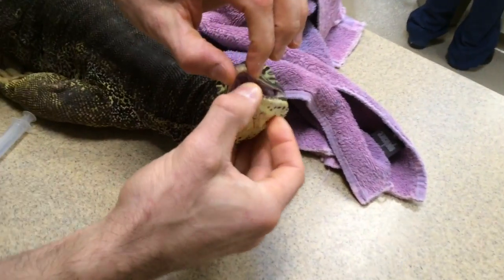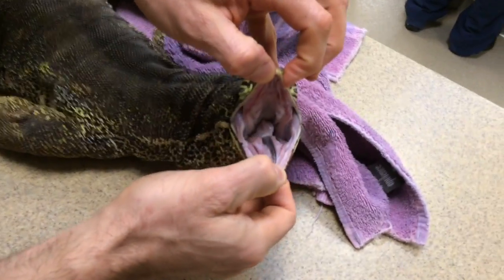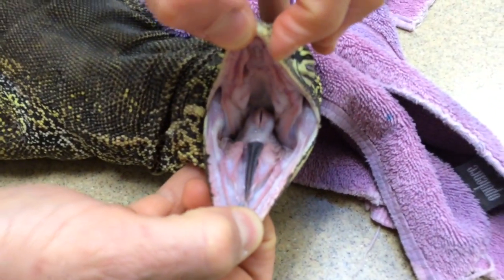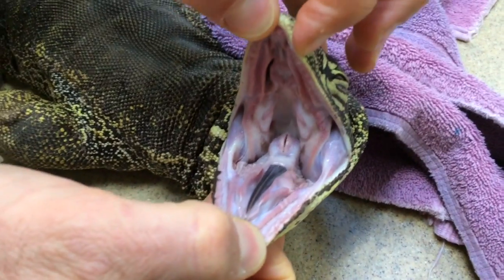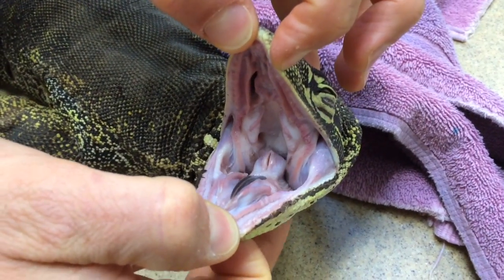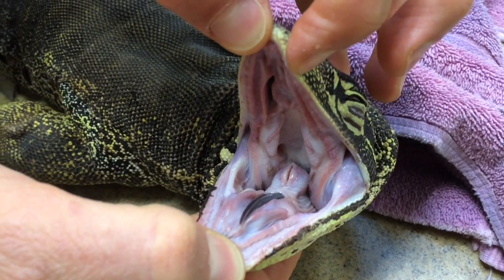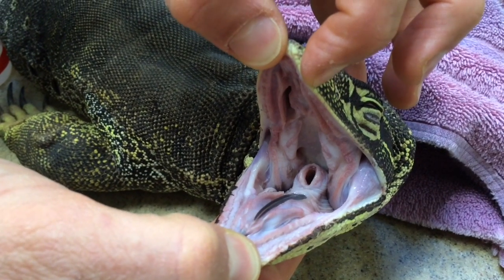Nice look inside the mouth — hopefully a little bit less jaw tone. You can see right behind the tongue, that's where we intubate and keep the airway open. It's closed right now but she'll open it up in a second. There you go — see it open?